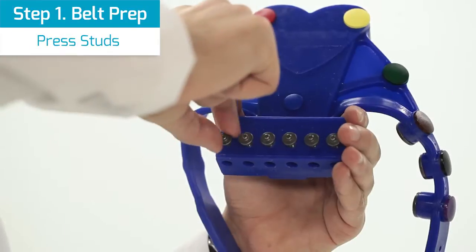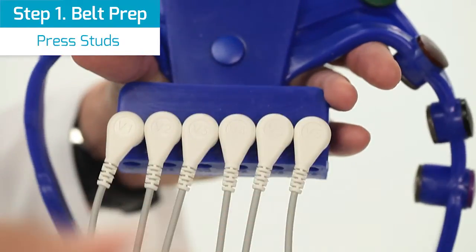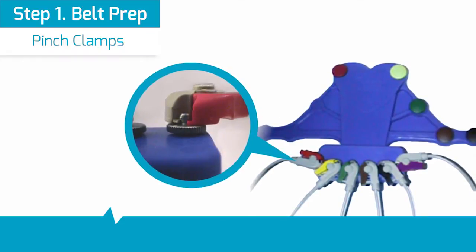Option 2: press studs. Ensure the screws are tightened, then connect the press studs to the screw heads. Option 3: note that pinch clamps may be used as well.